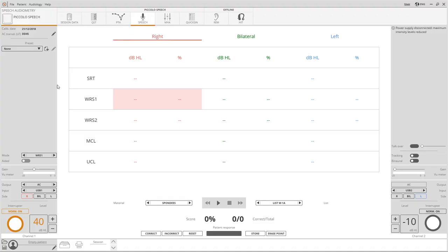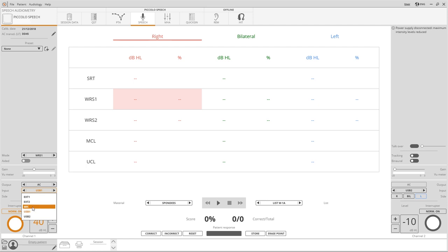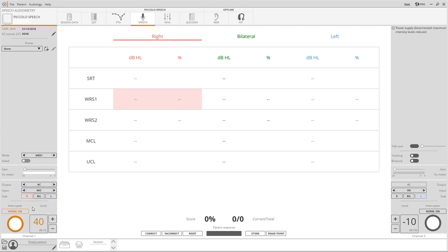Click on input to decide whether to play the speech material from the computer via USB or from an external source. With the mic input users can say the word directly into the microphone for the patient to hear.